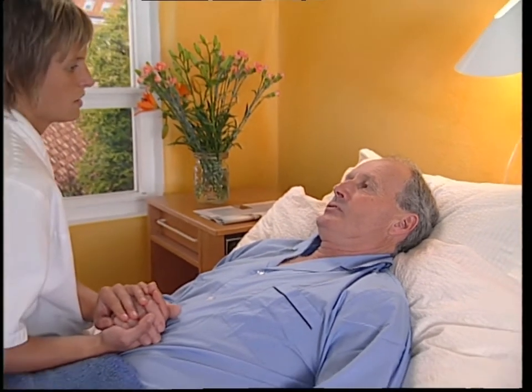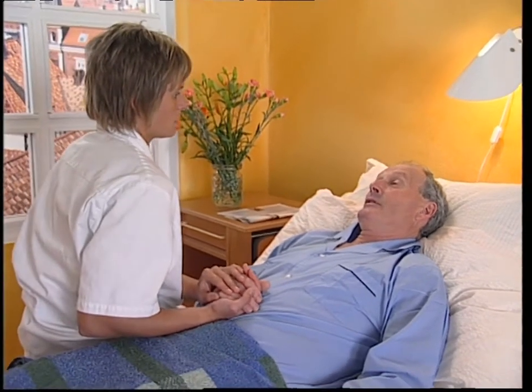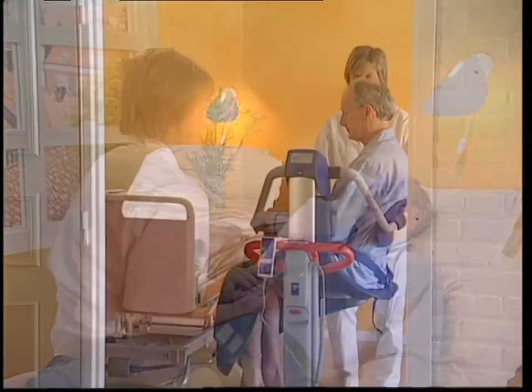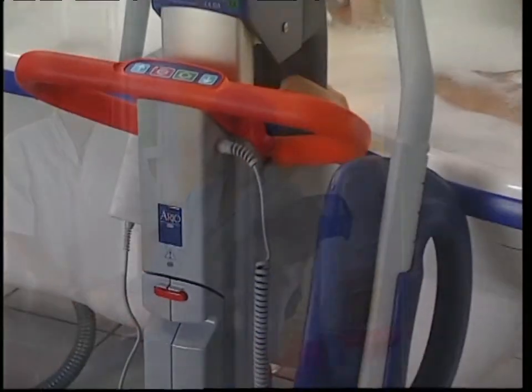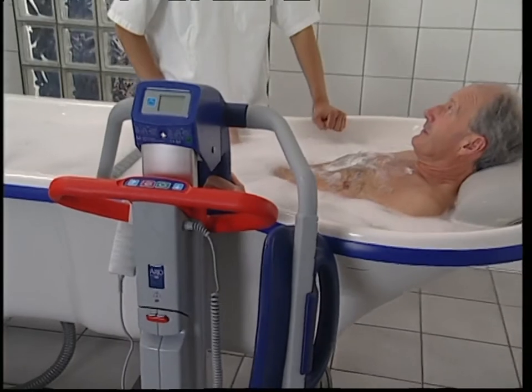Alenti simply makes life easier for the carer and resident. As part of an integrated bathing system, Alenti is a transport and transfer solution that enables a single carer to safely manage the entire bathing cycle.